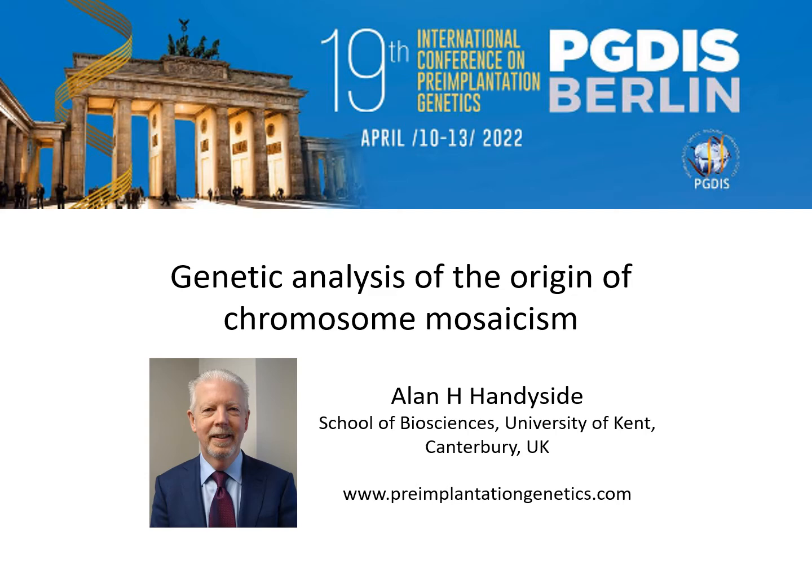My topic today is a recent study we published on the genetic analysis of the origin of intermediate copy number changes, or mosaic changes as they're often referred to, in multi-cell trophectoderm biopsies identified by NGS-based methods, using SNP genotyping and karyomapping to identify meiotic aneuploidies.